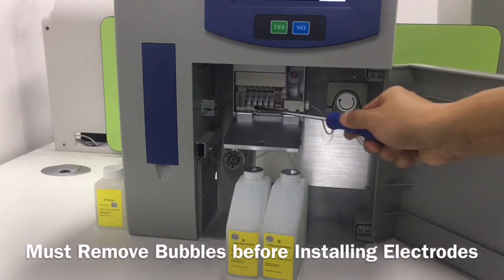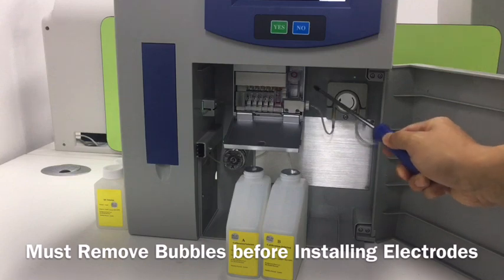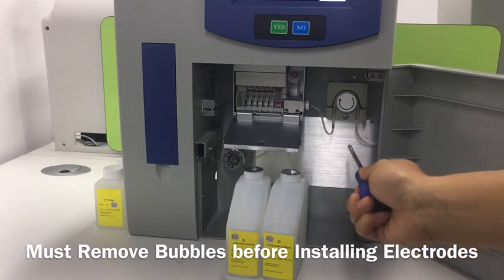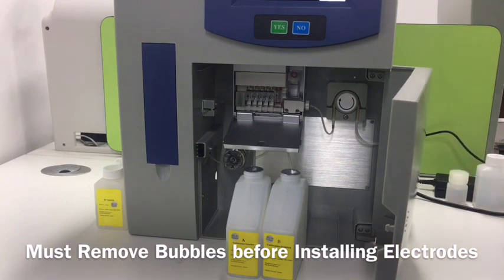First, we need to put the electrodes at the right place and lock the screw well. This is a pump tube and we let the tube go through the hole, so it can collect the waste — we can show that later.